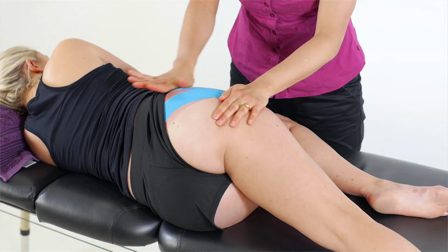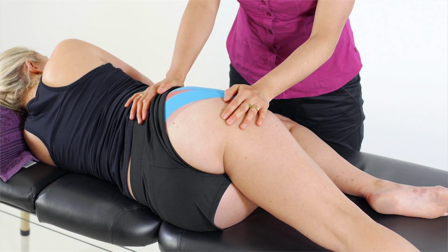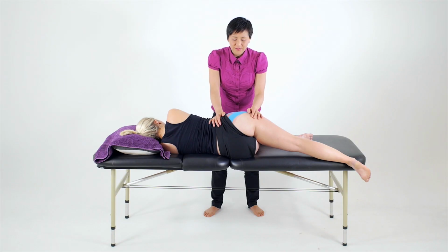Rub the tape to activate the glue, and as always, we'll reassess the muscle for changes in length as well as strength if that was in deficit, and contextually place this new application within the context of functional changes.